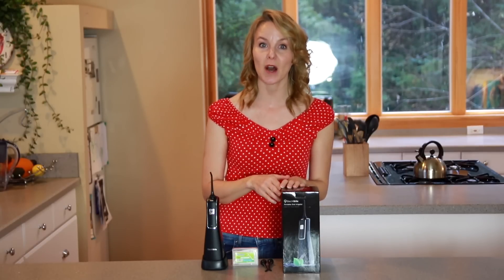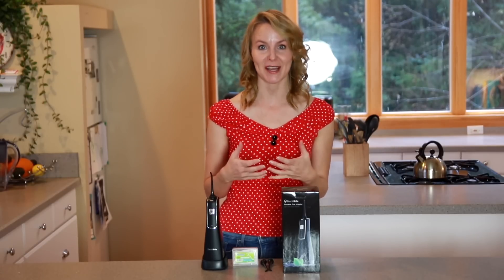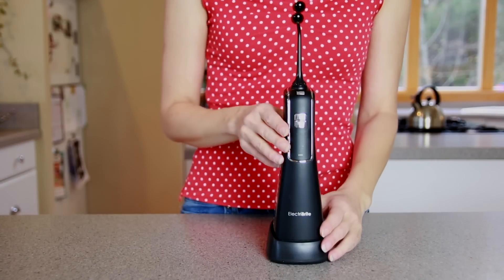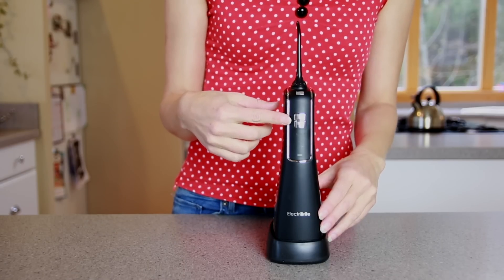Hello everyone. I'm here today to introduce you to the handheld water flosser from Electrobrite. Electrobrite is a new brand dedicated to creating a comfortable home life. This is an FDA approved professional water flosser with 1800 high pressure water pulses per minute, which effectively cleans the mouth, massages gums, and prevents oral diseases.